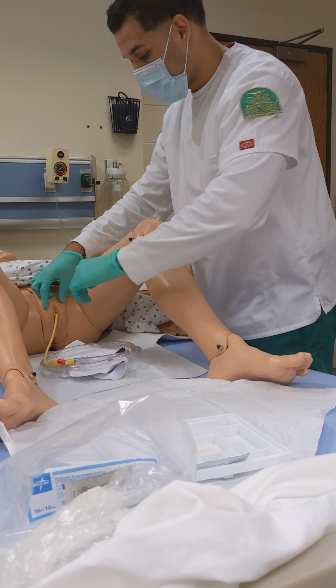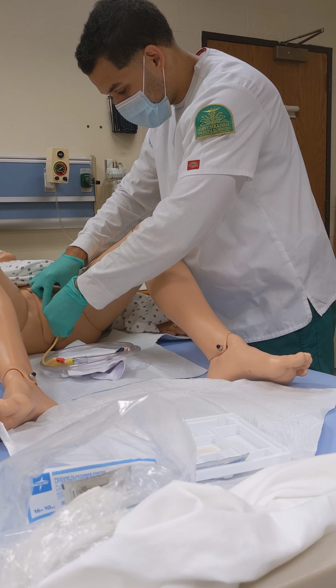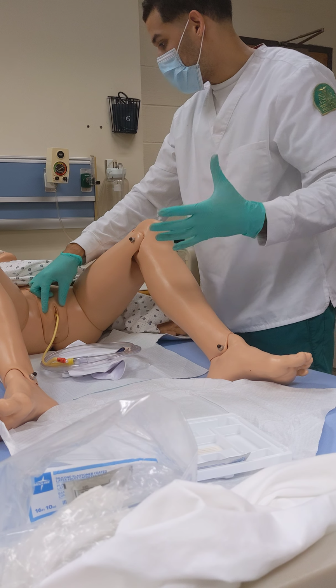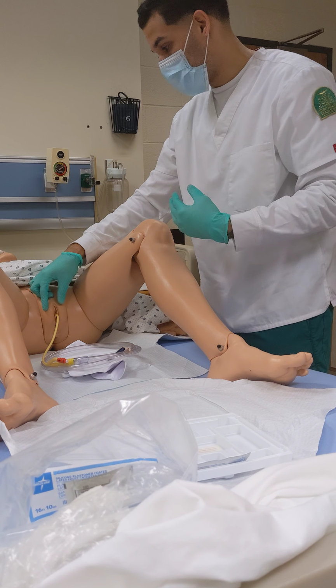I'm going to then slightly pull on the catheter to make sure that there's tension, letting me know that the catheter is properly inserted and the balloon is inflated.